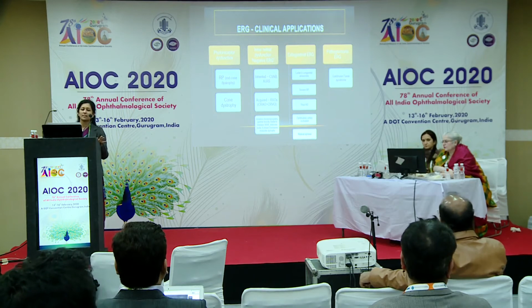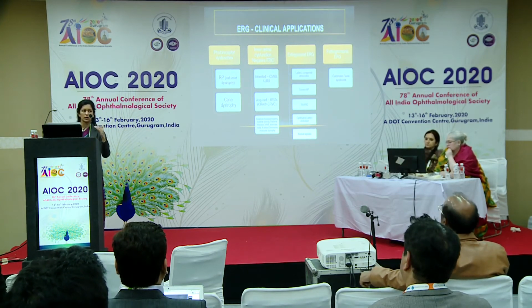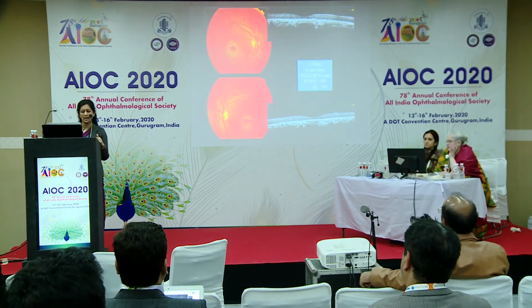There are only a handful of conditions which will give you an extinguished ERG. So if you get that, then you can easily sort out your diagnosis as well.